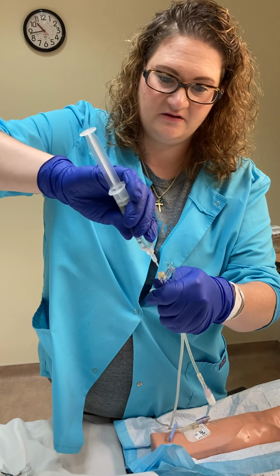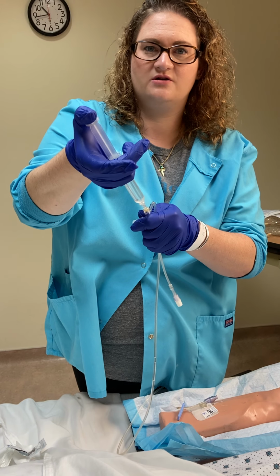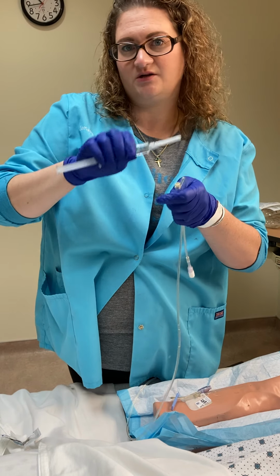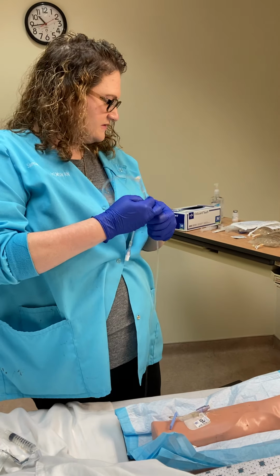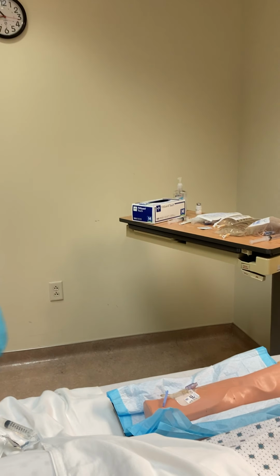Then you're going to take the cannula and stab into the center of it, and then you could aspirate for blood return and flush on your J-loop. Okay. We'll go over more with the simple connector when I show the CVAD stuff in a little bit. We're going to focus on the luer lock for right now with the peripheral.